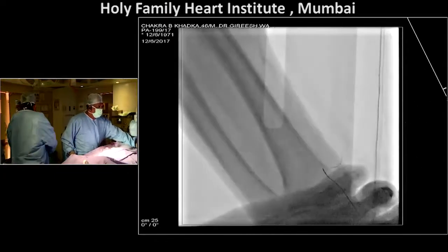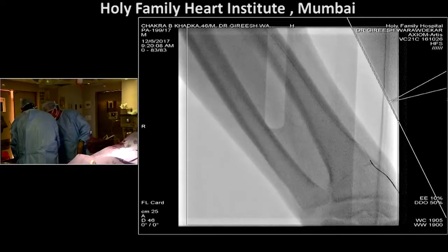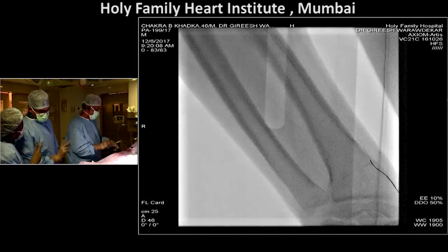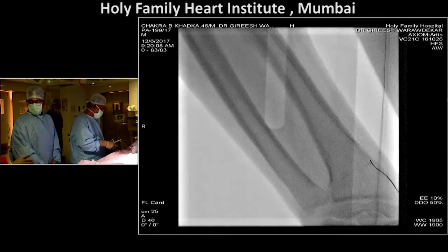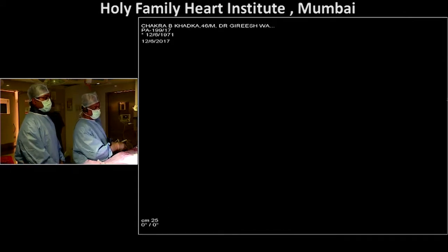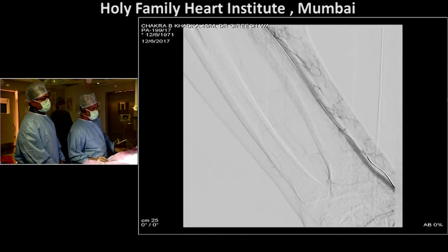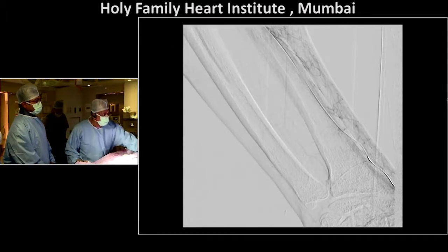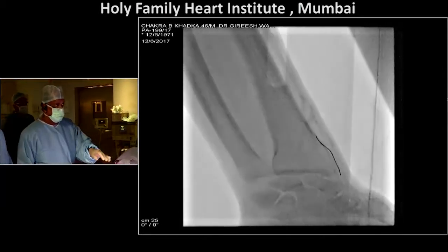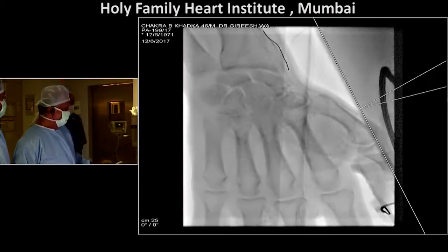Heparin, I've given a bolus of 5,000. Okay. Any suggestions from the audience and the experts here? A couple of things about vasodilators: when you have sluggish flow, giving vasodilators at the tip of a guide catheter doesn't get it to where you need it. So sometimes doing a distal injection of whatever he used, here a calcium blocker, makes a big difference. Getting the drug to the distal bed oftentimes makes the greatest impact. As far as heparin, we would check what we call an ACT, activated clotting time, and really shoot for something like 250 seconds.